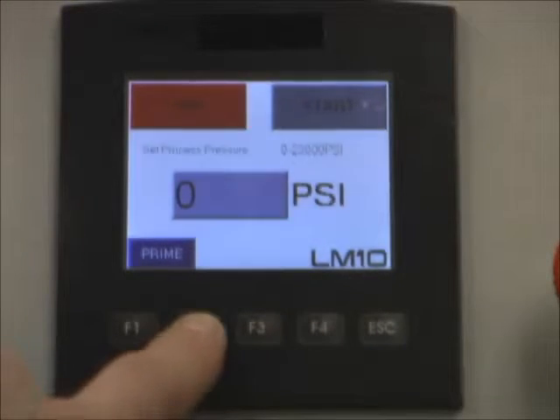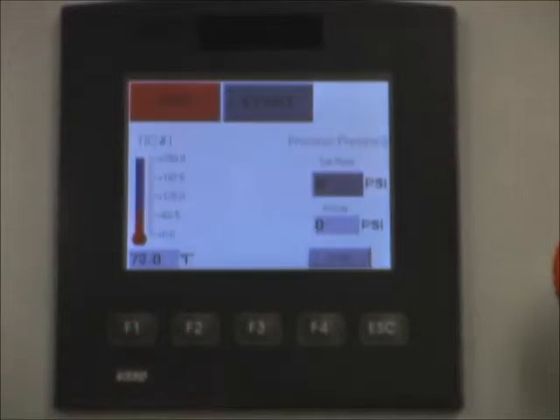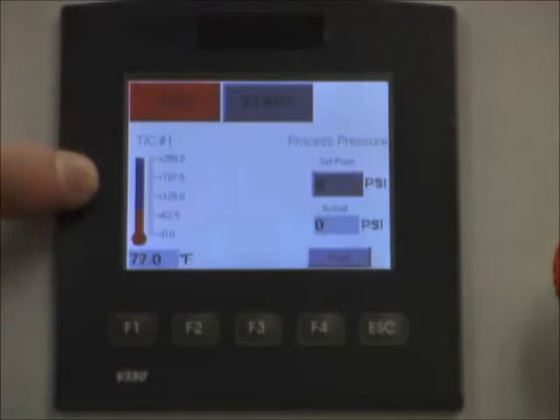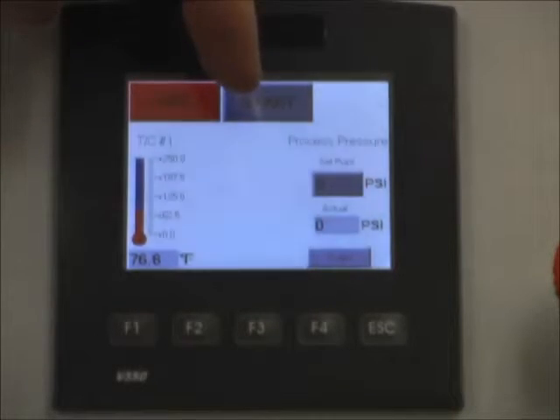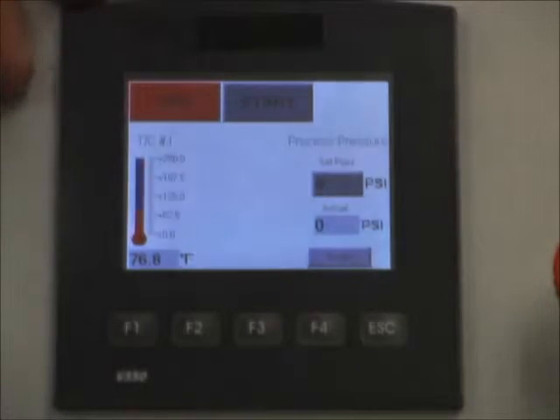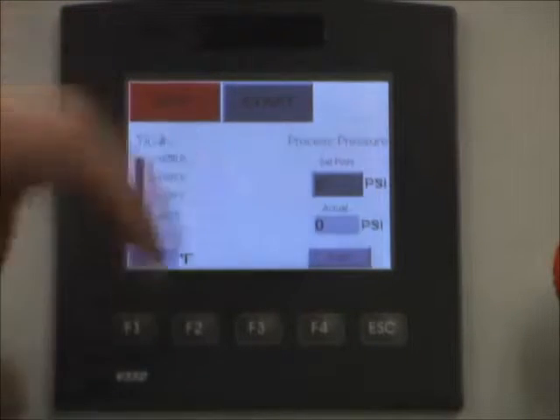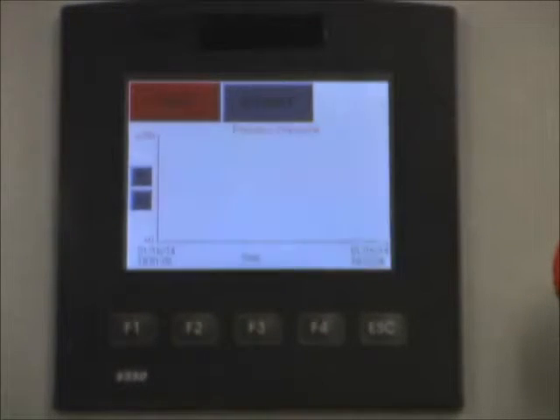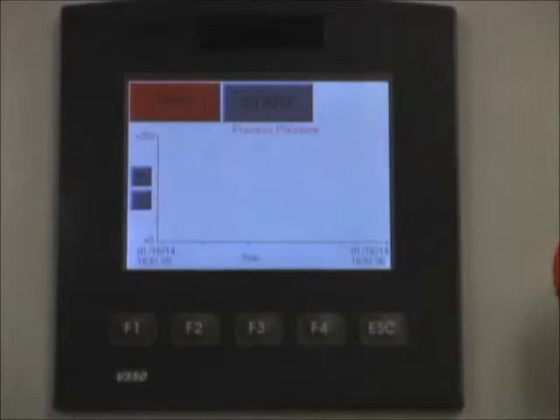We can continue on to the F2 screen. This screen mostly shows your temperatures. Again, we have the on and off control on the top. The first thermocouple input is on the left. If the second thermocouple input is selected, it will show up in the center of the screen. On the far right we can set our process pressure. There is a section for the actual process pressure — the feedback. There is also a graph button on the bottom right. If we select the graph button, a process pressure graph appears, and when we run the processor we will be able to see a visual representation of the pressure in graph format.